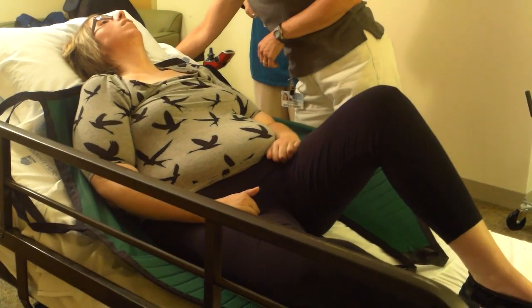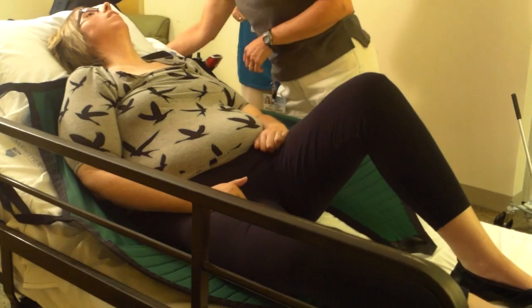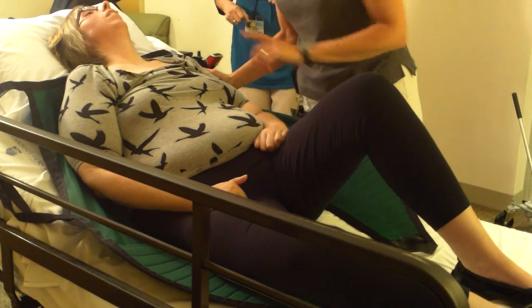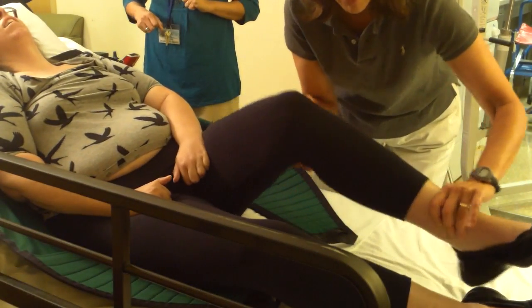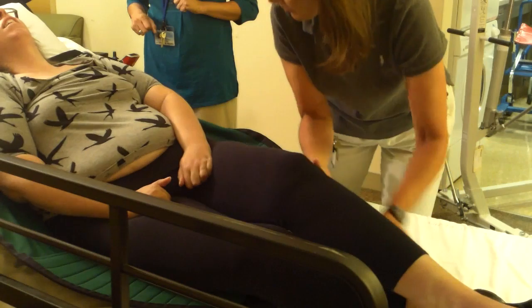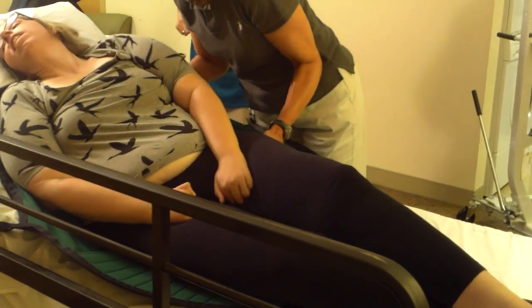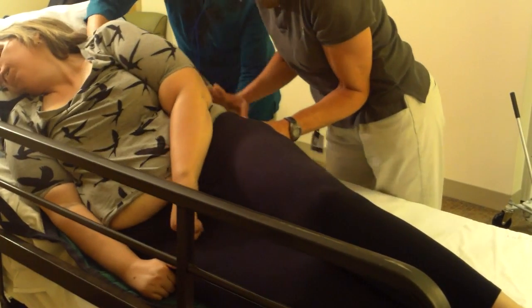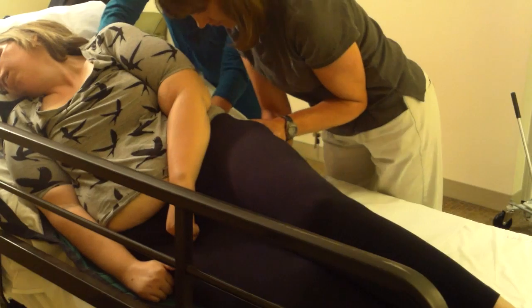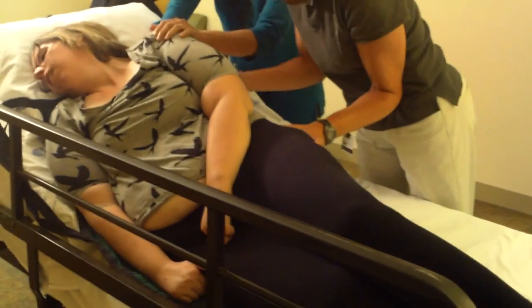You can make the bed higher or lower depending on your need for helping the patient so that you protect your back. You will probably now cross the patient's left leg over the right to be able to roll her towards the right and tuck that side of the lift pad underneath.